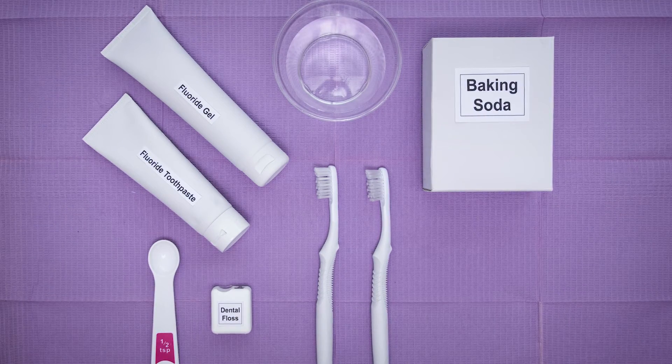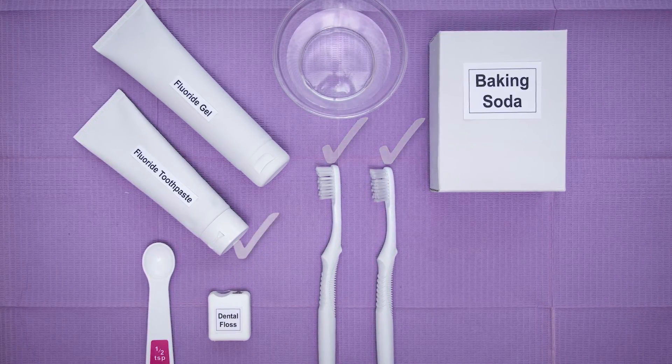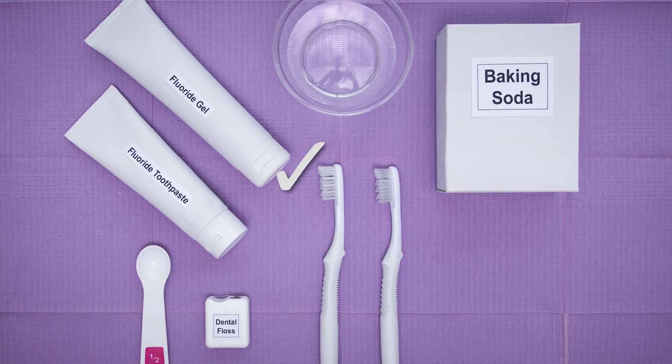To apply fluoride using the brush-on technique, you will need dental floss, two soft bristled toothbrushes, fluoride toothpaste, baking soda, a cup of room temperature water, and fluoride gel.